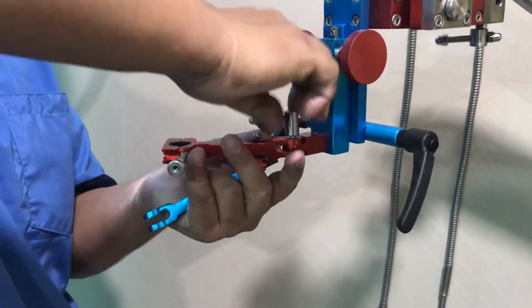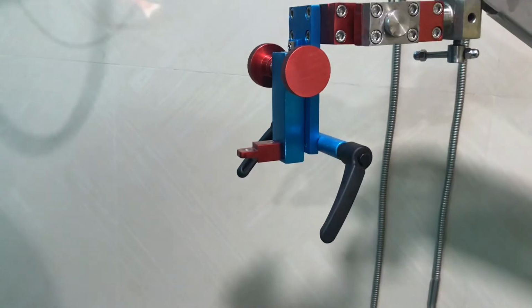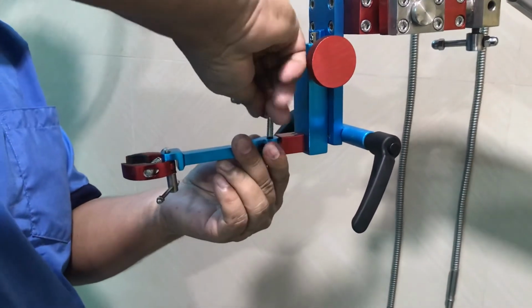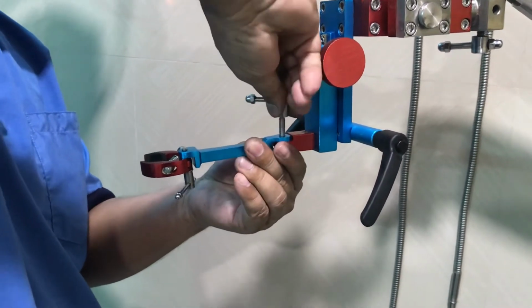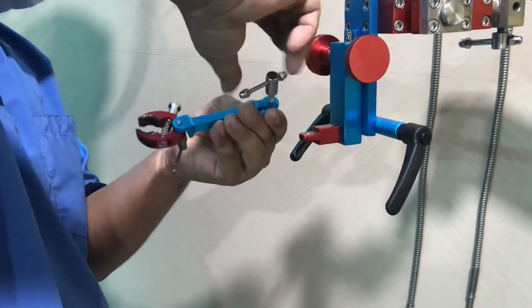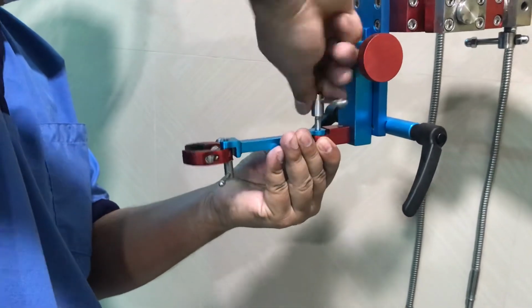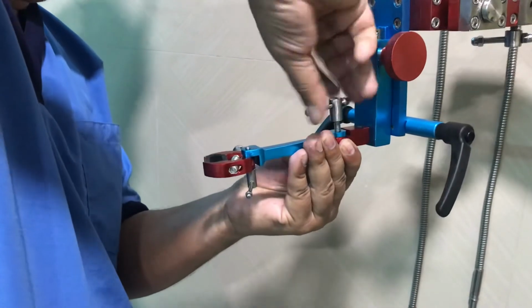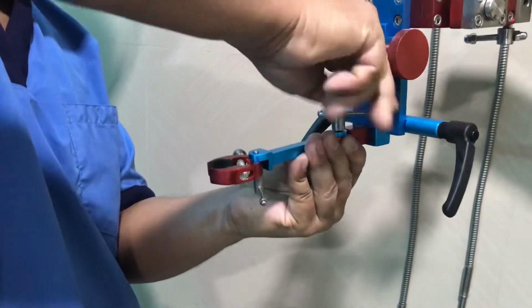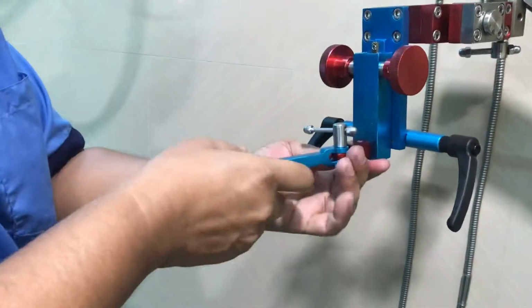So again, remove this. And then you can fix this. So it is fixed. Just rotate around it. So again, it is fixed like this.